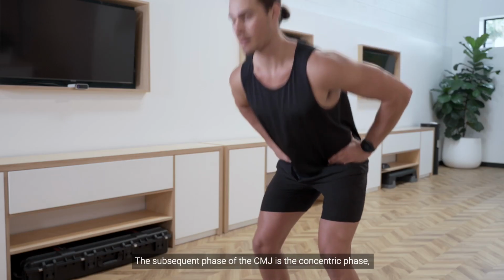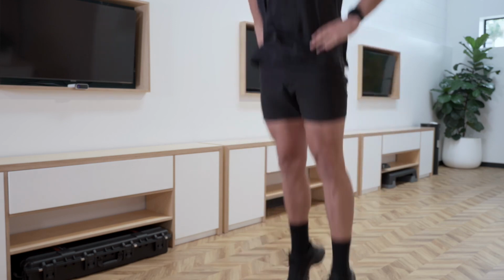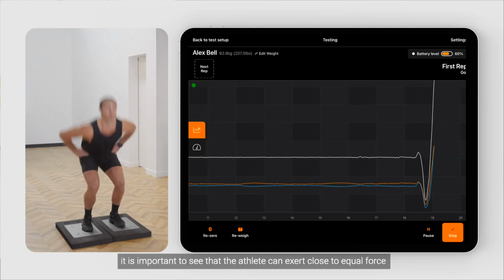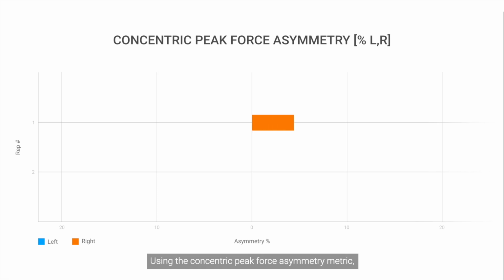The subsequent phase of the CMJ is the concentric phase, or upward movement from the lowest position of the squat until the takeoff. Just like the eccentric phase, it is important to see that the athlete can exert close to equal force through both legs when propelling themselves upwards into the jump. Using the concentric peak force asymmetry metric, we can visualize and educate the athlete on how much force they are expressing through either leg as they ascend towards the takeoff point of their jump.